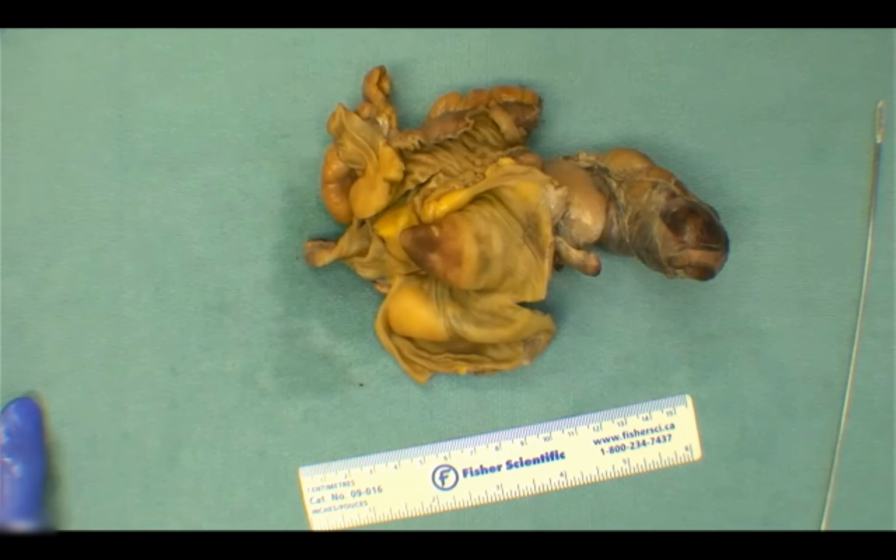So there may be some evidence of microinvasion, and why would that be important then? That's okay. We can go over that later. There we go. This could be something low grade. We'd have to examine the whole appendix to make sure there aren't any high grade elements, and then to stage it appropriately. Absolutely. Going back to your microinvasion, yeah, because it'll relate to perhaps staging and treatment, could be related to seeding elsewhere. There could always be a small adenocarcinoma hanging out inside.